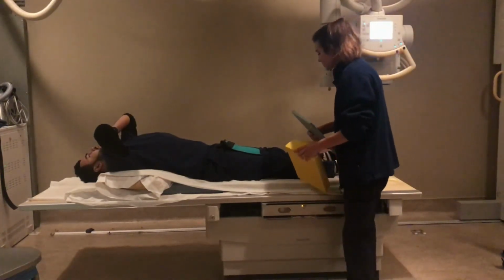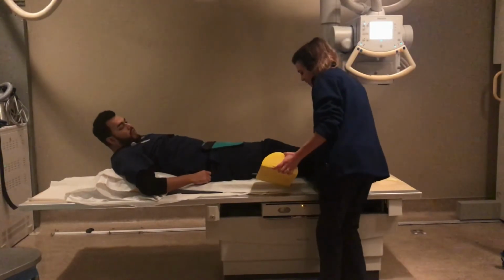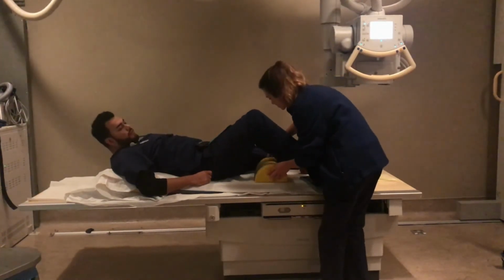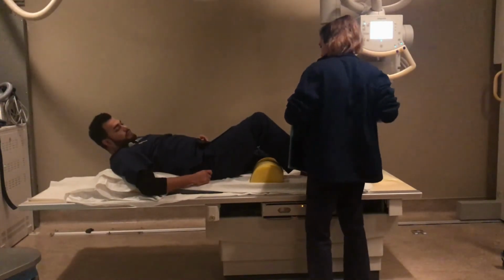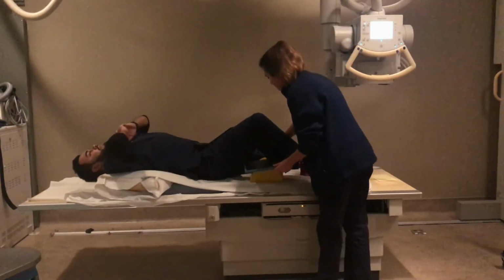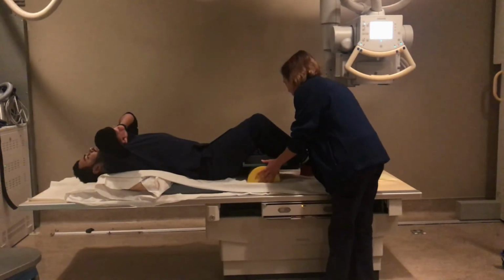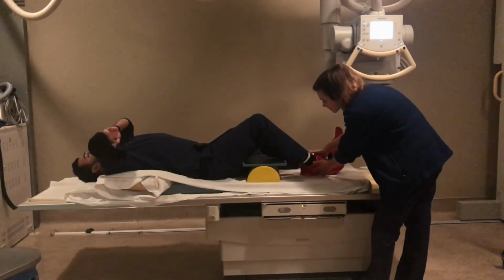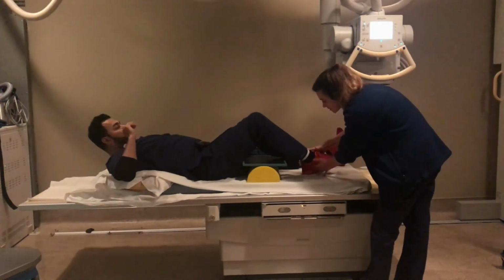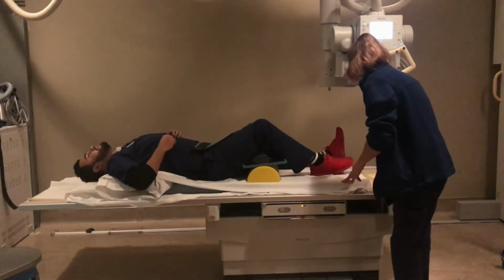So what I'm gonna have you do, Phil, is just go ahead and bend your knee up. I'm gonna put this under here, and then we're also gonna put the IR under. And so the little green strip goes to your right. Okay. And then go ahead and just move your foot forward for me just a little tiny bit. Right about there.